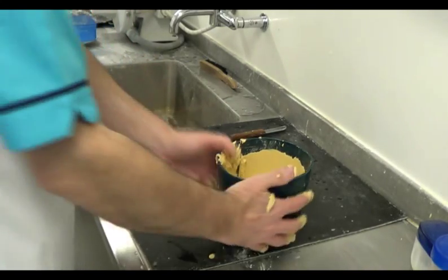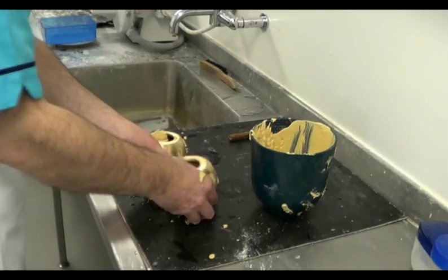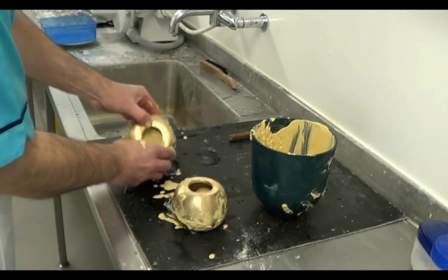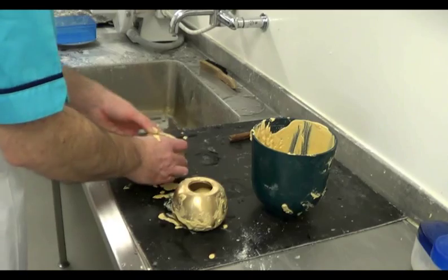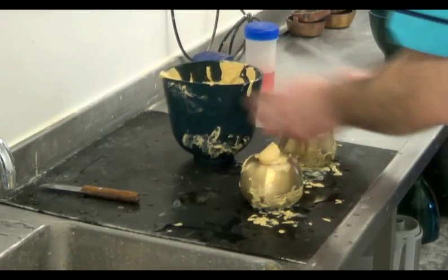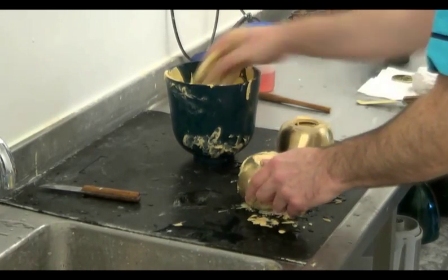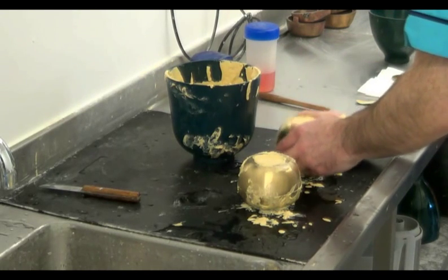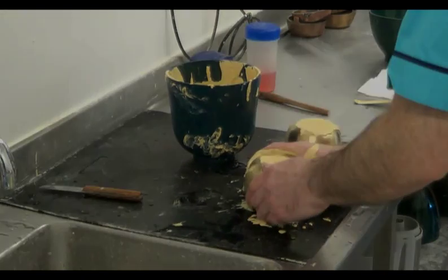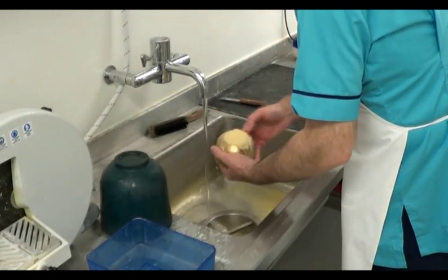Once the wax shapes are totally covered with the stone material, we can fill the deeper portions of the flask with it. As the material hardens, we can wash the flasks in order to leave things nice and clean.